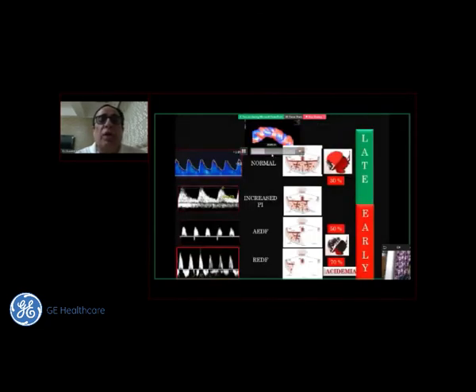Now, when you look at the Dopplers, as he just said, you will have a normal Doppler with good diastolic flow. With increasing placental resistance, you may see increased PI, absent end diastolic flow, reversed end diastolic flow. And this is a reflection of the perfusion from the fetal side, depending on the placental damage, that is the placental insufficiency. Now, the earliest sign that you start seeing umbilical artery changes is when the placenta is deficient by more than 30%.